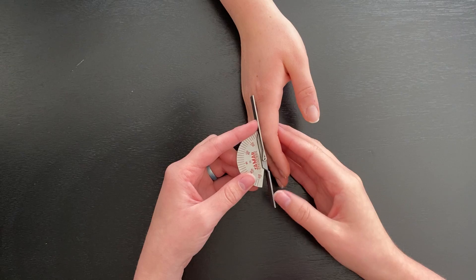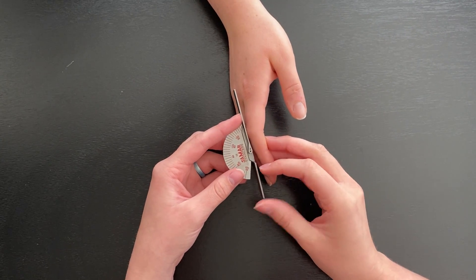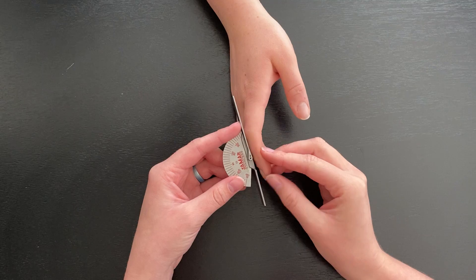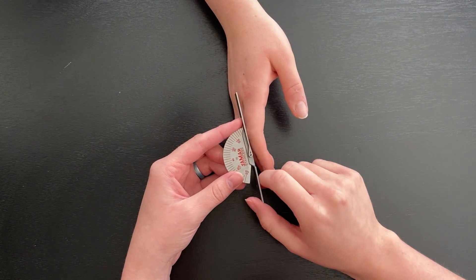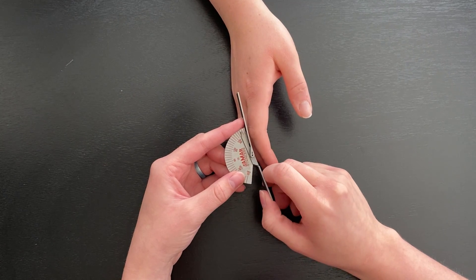The axis placement of the goniometer is going to be the dorsal side of the DIP joint. It's right here. The goniometer will start open and it'll start at 0 degrees and this specific one each line is 5 degrees.